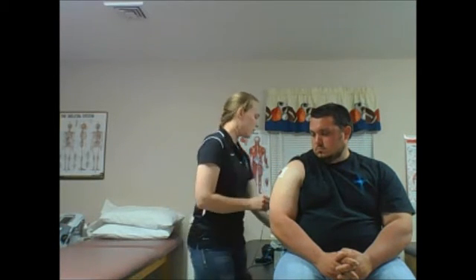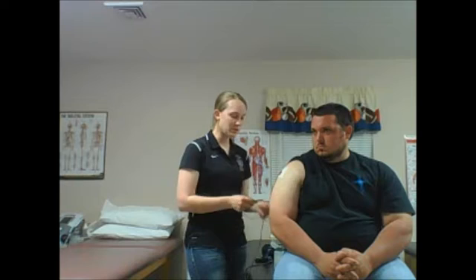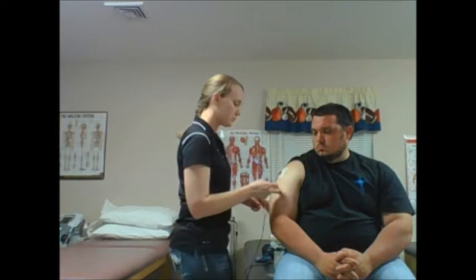Okay. Now you also want to use the disperser pad. It needs to be appropriate amount away. So the disperser pad needs to be 3 to 6 inches or 8 to 15 centimeters away from your active lead.